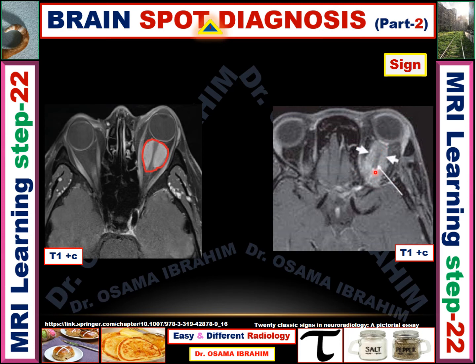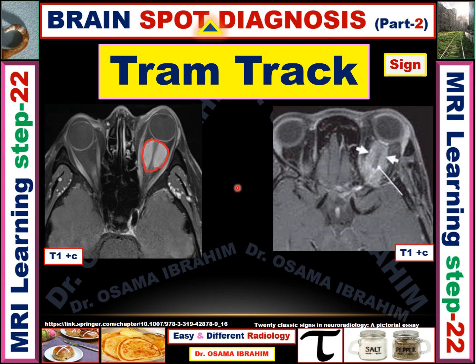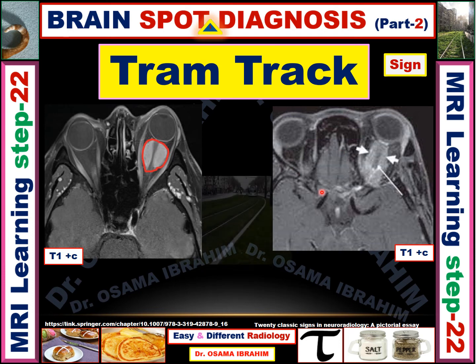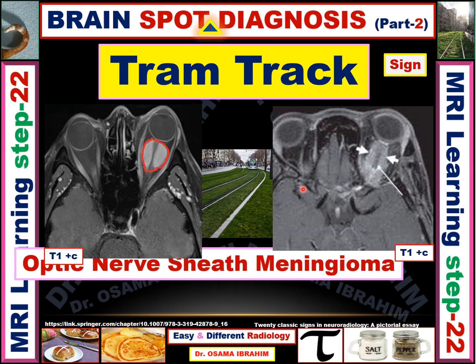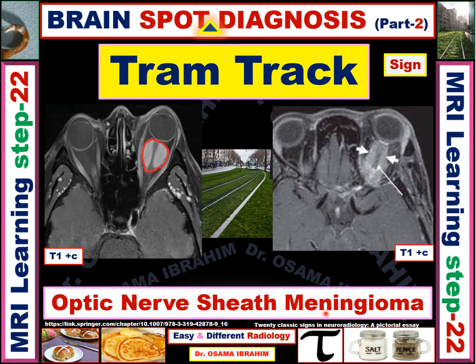However, comparing with the abnormal side, there are enhancing lesions on both sides of the optic nerve. The optic nerve appears in the center of the lesion, forming a track — this is the tram track sign. This is another patient also showing the tram track sign, with homogeneous enhancement. The tram track sign in the optic nerve region represents optic nerve sheath meningioma.